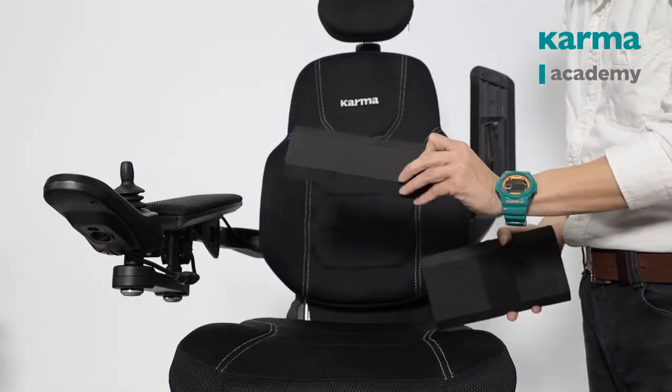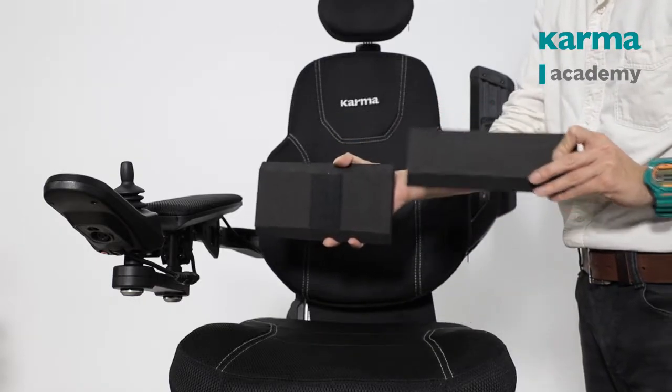The support includes two pieces. You can use either one of them or combine them together.